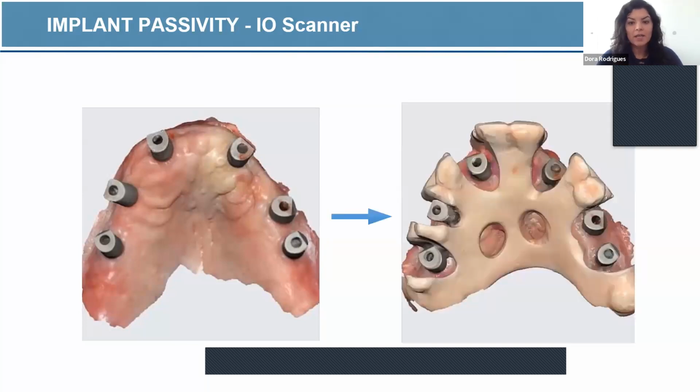And there are techniques that I see doctors using, and I apologize, I grabbed a couple of these next slides. They're just screenshots that I took from the internet and Facebook. I don't own these pictures. I don't have the doctors' names or technicians or whoever posted them, but these are not mine. It's just to show you that doctors and technicians are coming up with ways to try intraoral scanning for full arch. You might create a denture with some slots to basically reduce the span of the gingiva between the scan bodies to accurately scan them together.